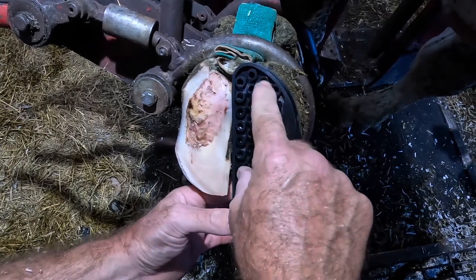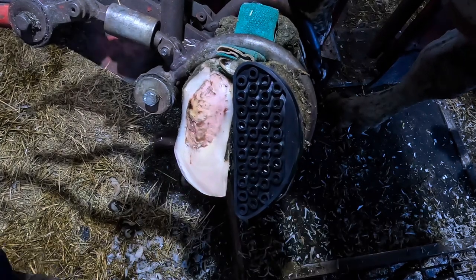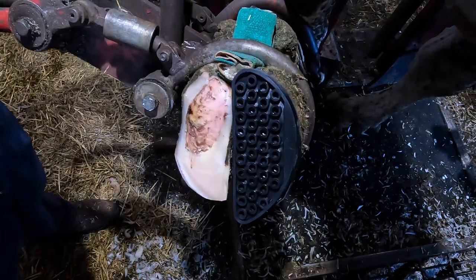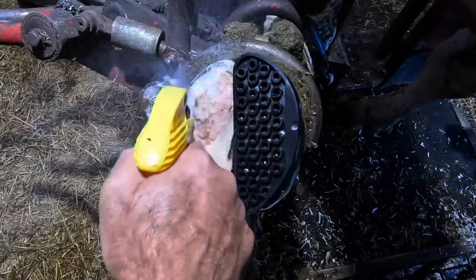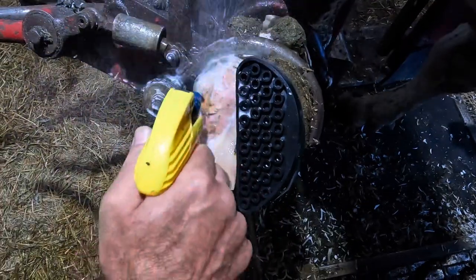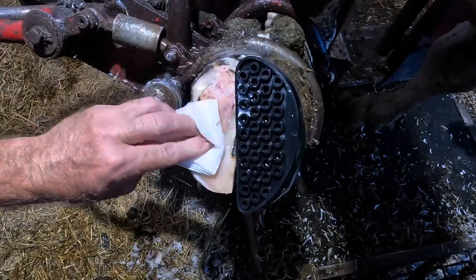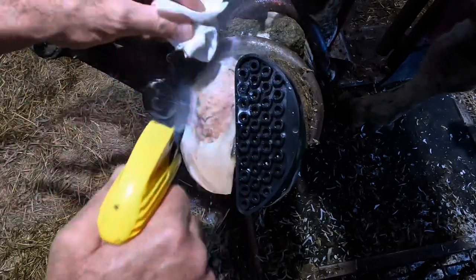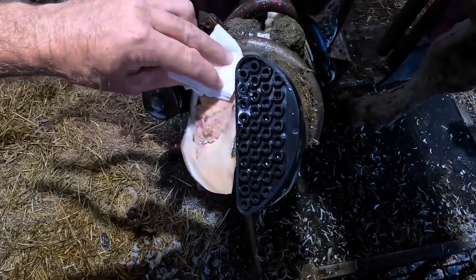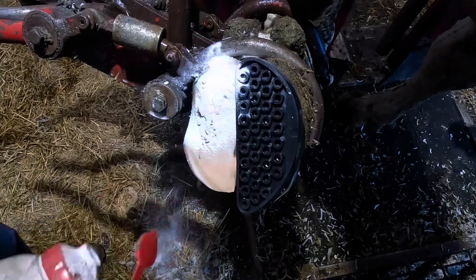What I'm going to do now is put a block on the other claw. What that's going to allow is all the pressure removed from that injured claw. That's going to allow not only no pressure to be put on that injured claw, but it's also going to allow that white line and sole junction to form without anything impeding it, without any pressures being applied. That's going to allow this foot to get off to the right start and hopefully we don't have to deal with this ever again.